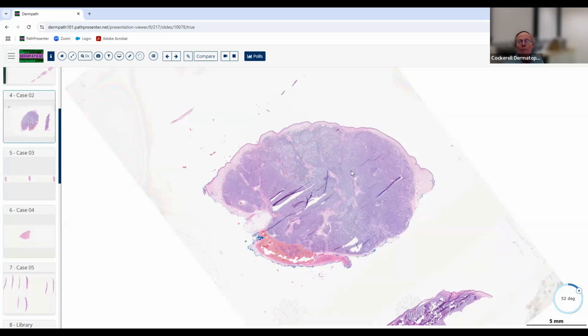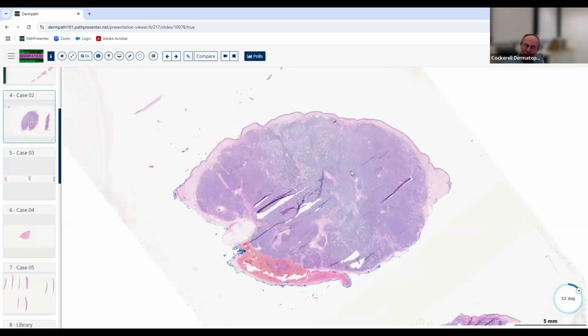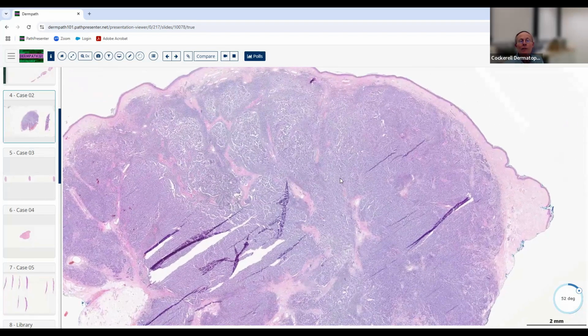So we know that if it's perhaps a metastasis, it can break the rules a little bit of whether it's well circumscribed or not. If you get a cannonball metastasis, say from a melanoma or from a carcinoma, breast cancer, or maybe a lung cancer, those can sometimes look well circumscribed. It can be relatively small sometimes. So they break the rules of the low magnification pattern analysis. And this doesn't involve the epidermis, so theoretically it could be a metastatic lesion. And so we go to higher magnification.